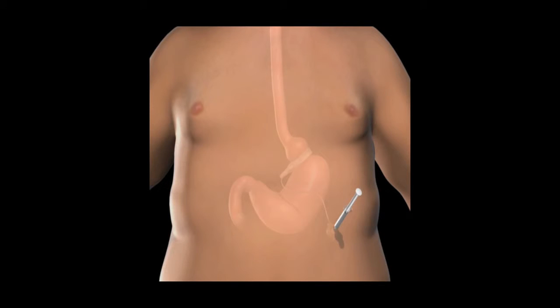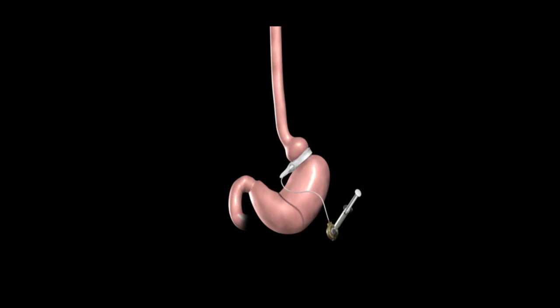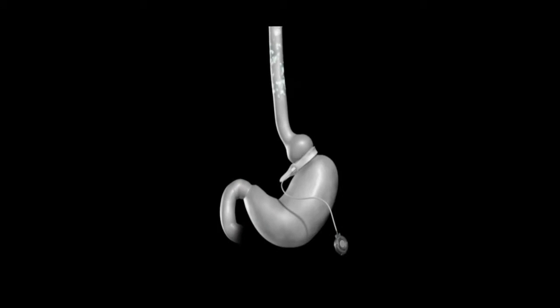Your surgeon may tighten the realize band by injecting saline into the injection port. As the saline is introduced to the realize injection port, it travels through the tube to the band. The addition of saline to the band creates a smaller upper stomach pouch. This smaller stomach pouch restricts the amount of food you can eat before feeling full.